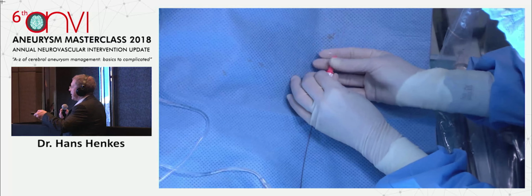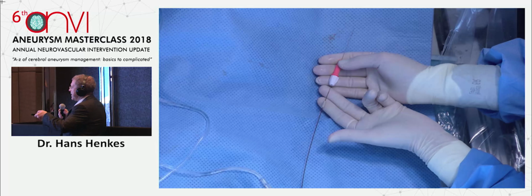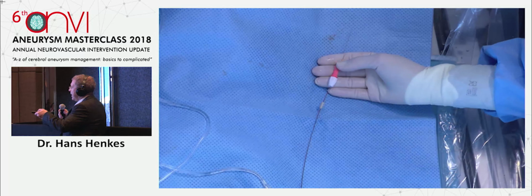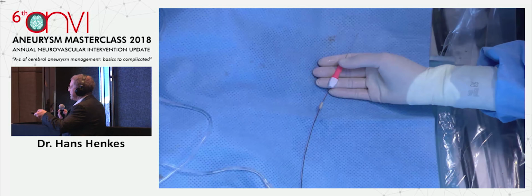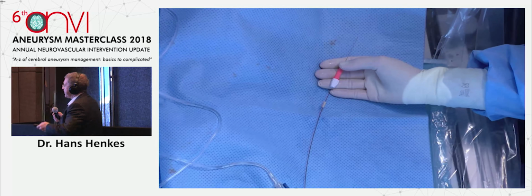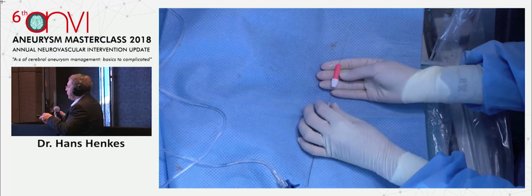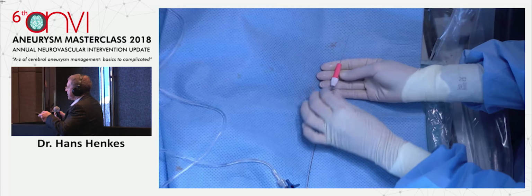So she's holding this piece and closing the torque device, with a reasonable distance between this plastic holder and the torque device, about 2 fingers, and then she will hold the torquer and move the tube towards the torquer in that direction.